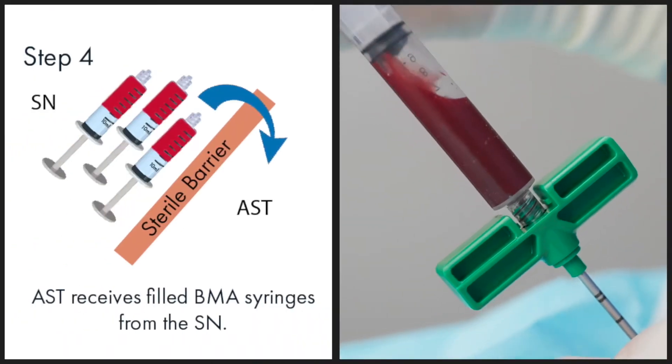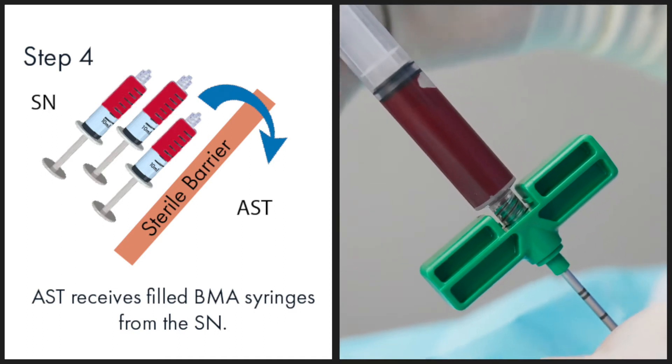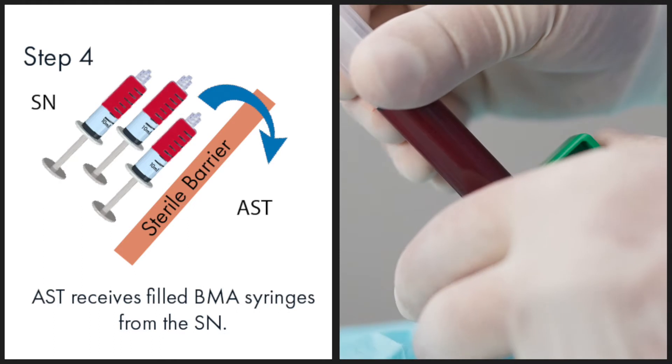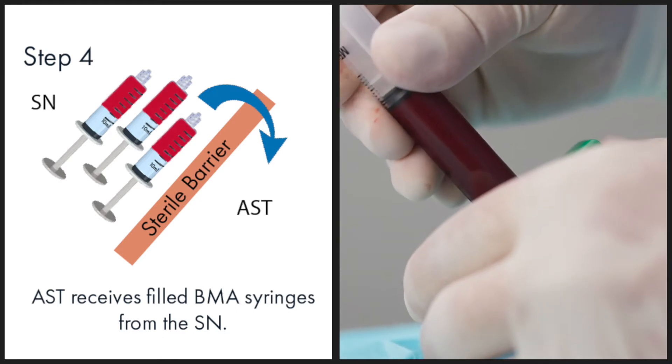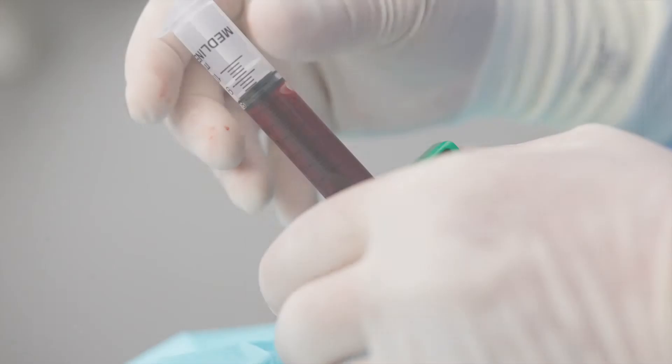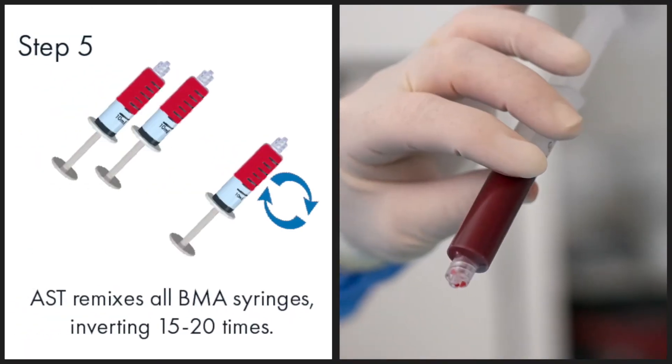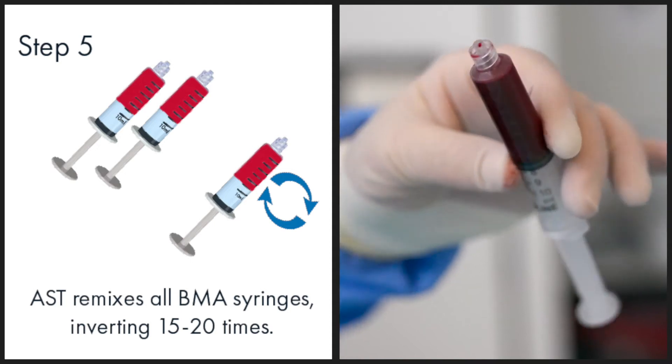Assistant receives the bone marrow aspirate filled syringes from the scrub nurse. Assistant will remix all of the bone marrow aspirate syringes by inverting 15 to 20 times.